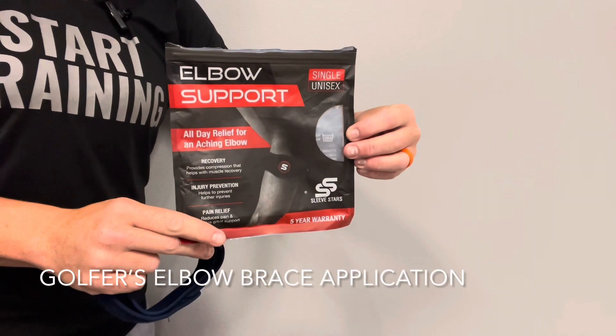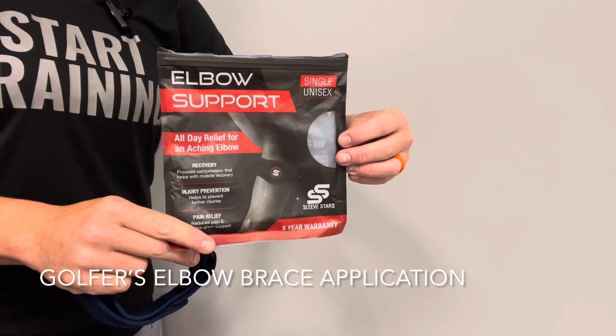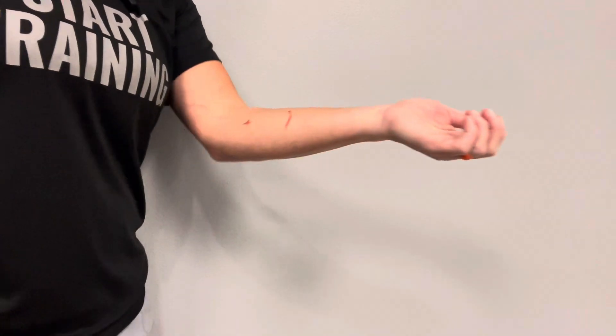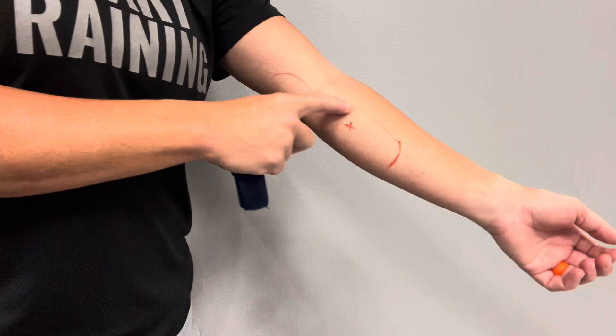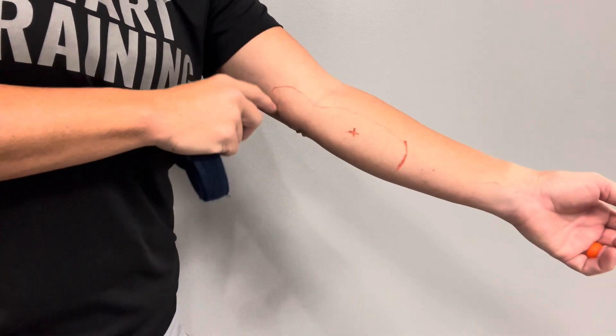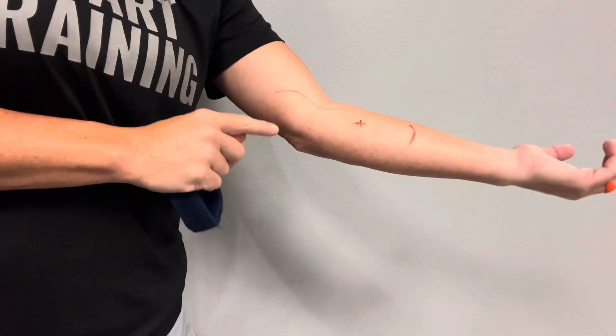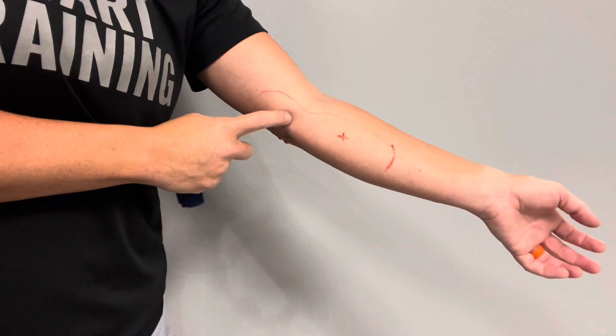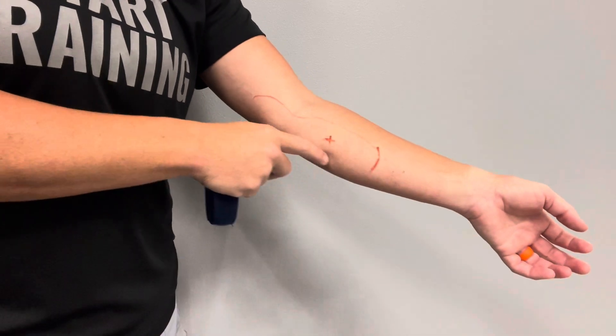We're going to go over how to apply this elbow support brace for golfer's elbow. Golfer's elbow is a little bit different than tennis elbow — it's going to be on the inside. Just because you have golfer's elbow doesn't mean you play golf; you can get it from playing tennis or other things. This marked area right here is where you can have pain all the way above the elbow on the inside or all the way down into the muscle belly.